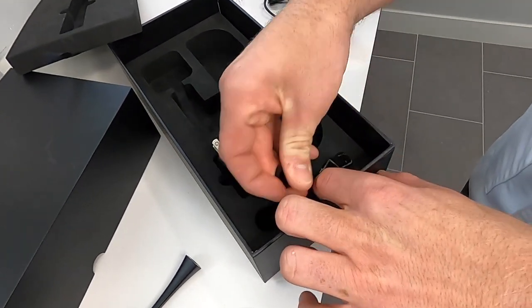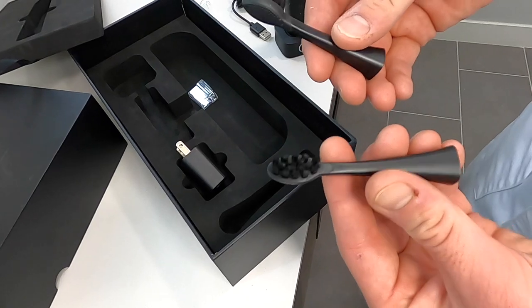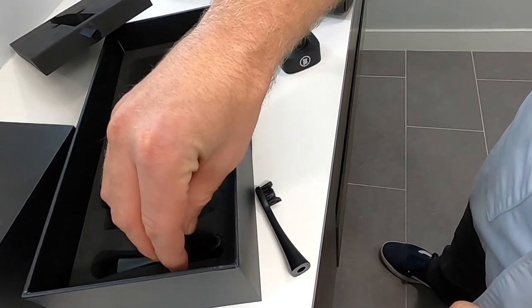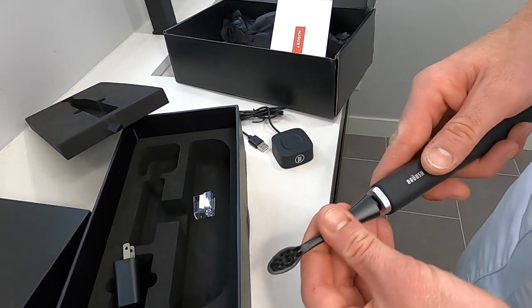This toothbrush comes with three different brush heads, which is great. It should last three to six months, so you use each one for about two months before throwing it away. And that's the package — pretty sleek looking toothbrush.